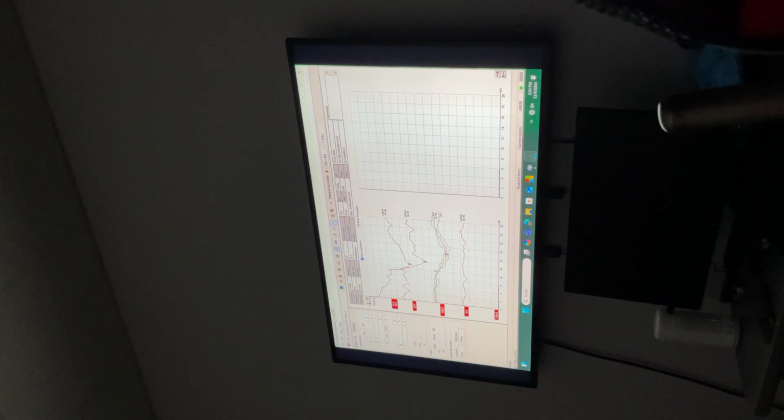You can see the 20 dB, it's so big. Like 20 dB is like normal hearing level. Just directly you could apply 20 dB. And you need not, like we could see the response at like 1,000 sweeps. So have like 1,000 to 1,030 sweeps minimum. You see a response, be confident, stop it.